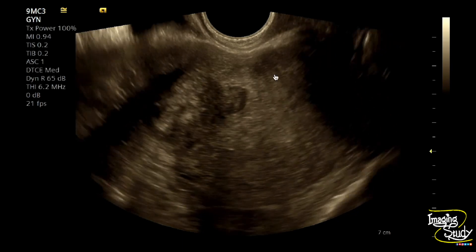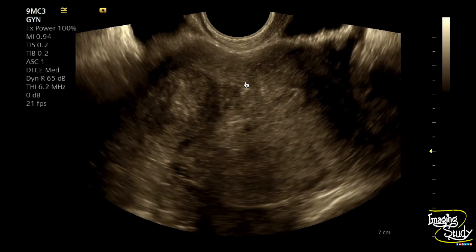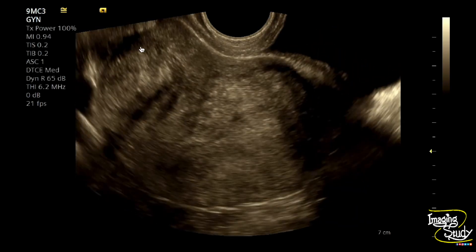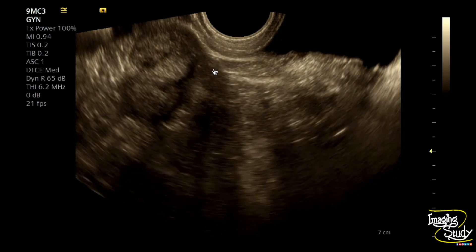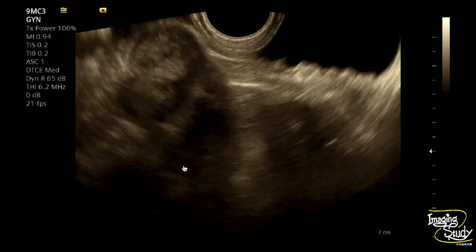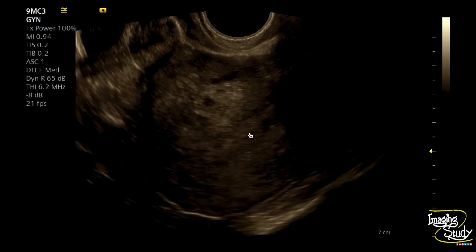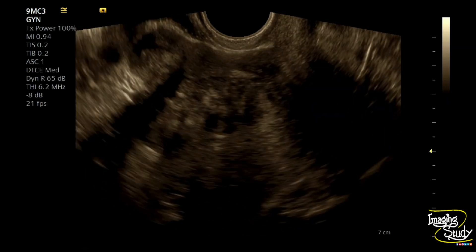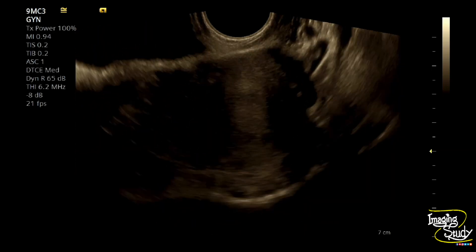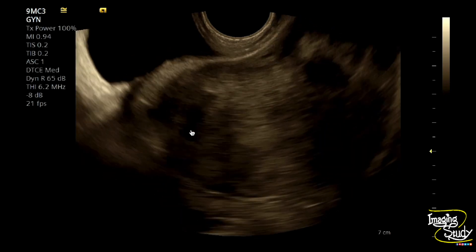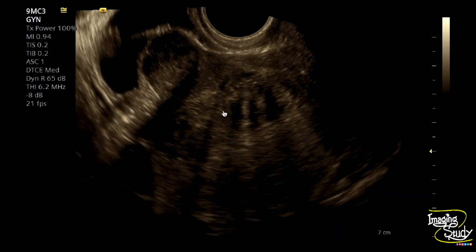Let's go for the fibroid. Here's the transverse section of the uterus. You can see multiple heterogeneously hypoechoic areas at the anteromyometrium. These are well-defined, and one is indenting towards the perimetrium making it slightly irregular, indicating the subserous variety. Others are confined within the myometrium with none indenting towards the endometrium, so these fibroids are of subserous and intramural variety. These fibroids are heterogeneous — keep in mind this patient is 50 years old, so expect some degenerative changes within these fibroids at this age.